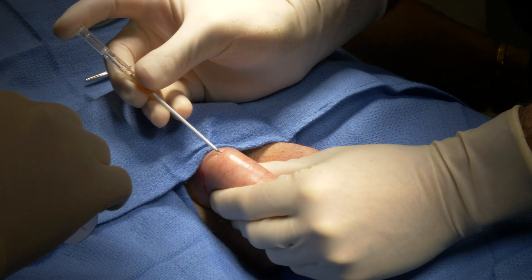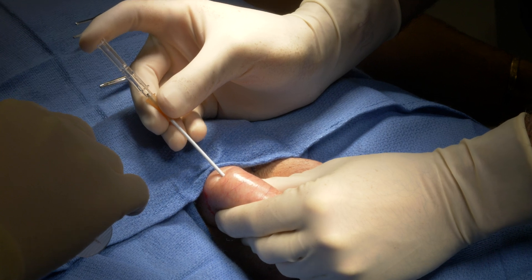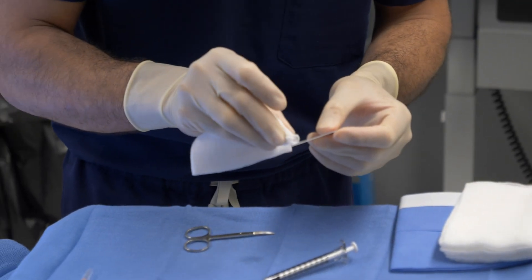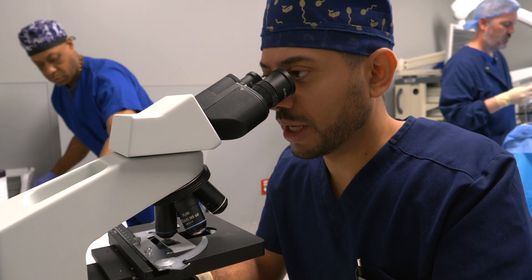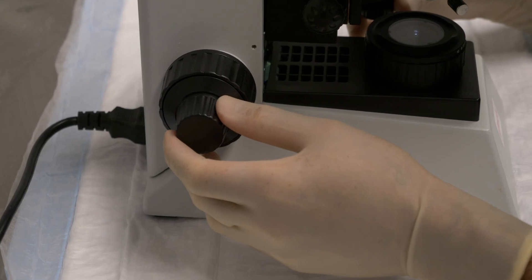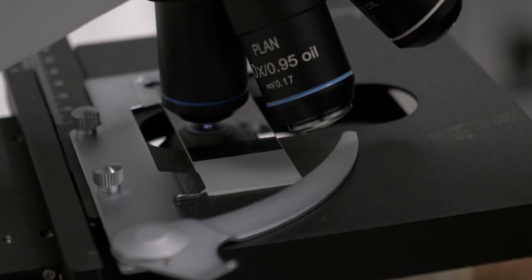I then took a very small sample from that tissue, morcellated the tissue, and placed it on a microscopic slide. What we're doing under the microscope here is examining tissue obtained from the testicle — seminiferous tubules. I've morcellated those tubules to express sperm out from within them, and now we're looking for sperm under the microscope.